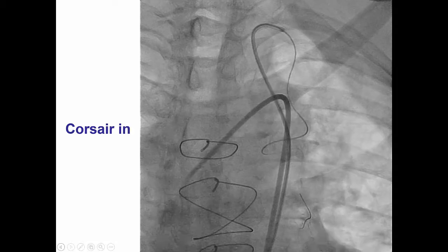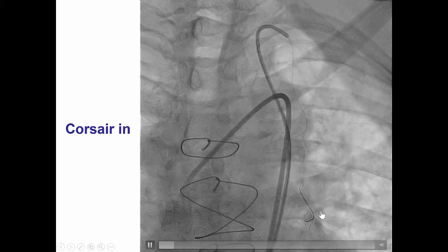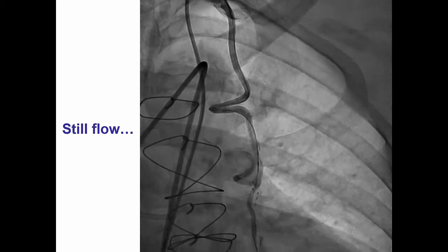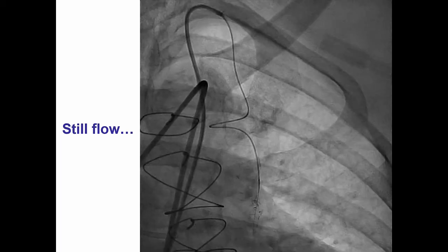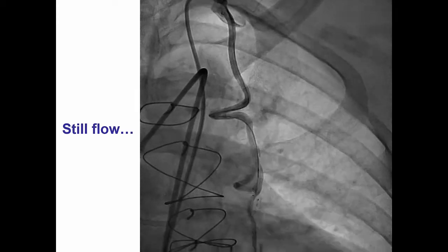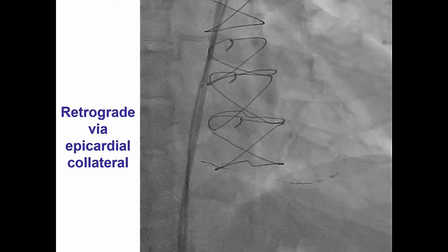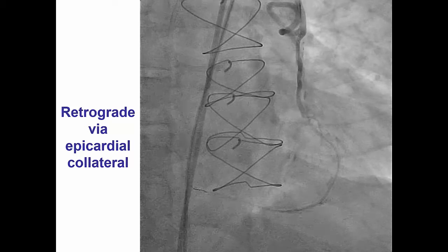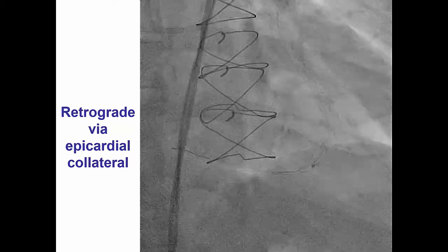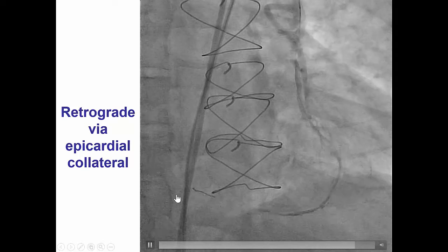Then we advanced the Corsair. You can appreciate how tight those turns are. We waited a few more minutes to see if the patient tolerated the procedure well. Fortunately, the patient was doing well with continued flow in both the LAD and the obtuse marginal branch. We were therefore able to easily cross this large epicardial collateral from the obtuse marginal all the way into the right posterior descending artery.